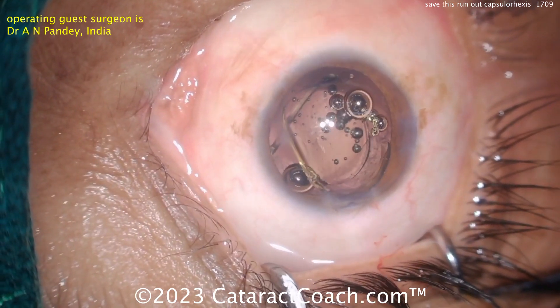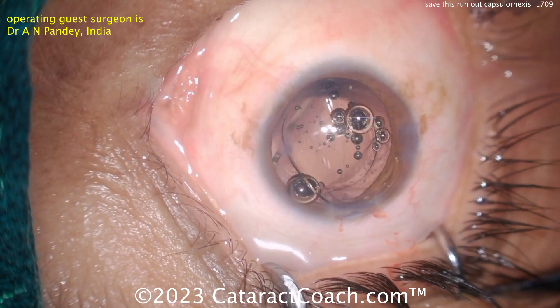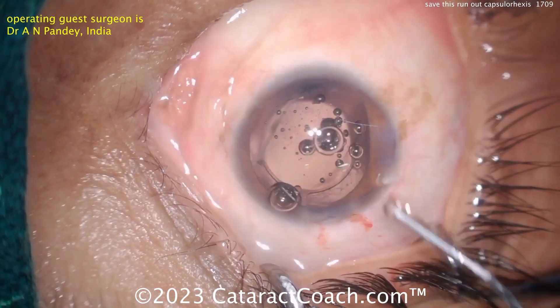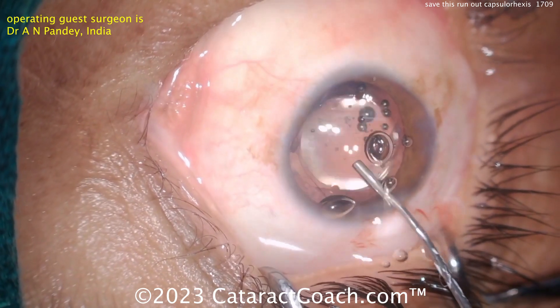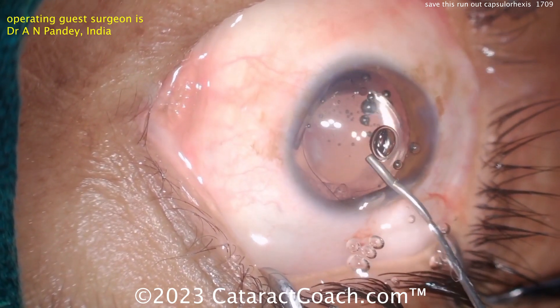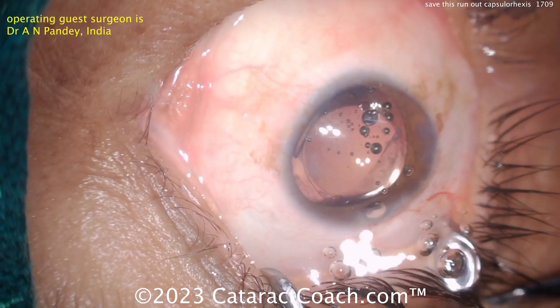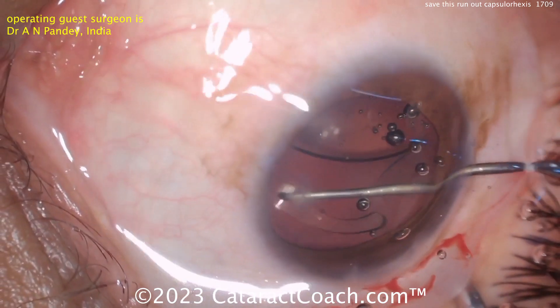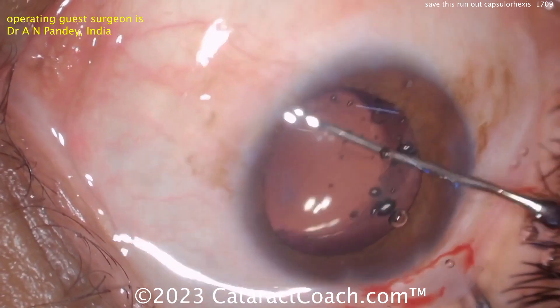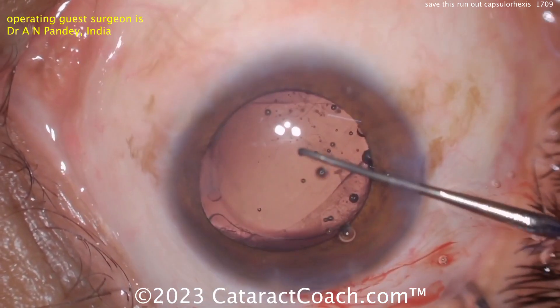Here comes the lens — single-piece acrylic. 7L rule: there's the seven, there's the optic, and there's the capital letter L. So the 7L rule is intact; you have the anti-S configuration. Get that in the bag completely. This is a case where you want to just get out of town and get this case done.